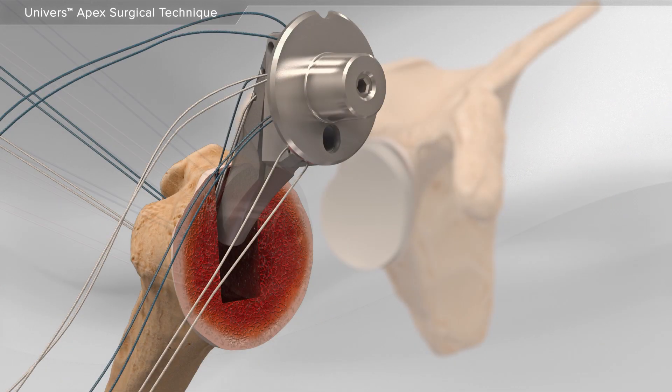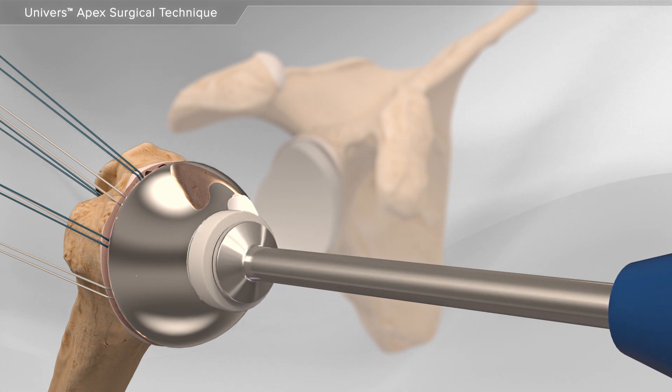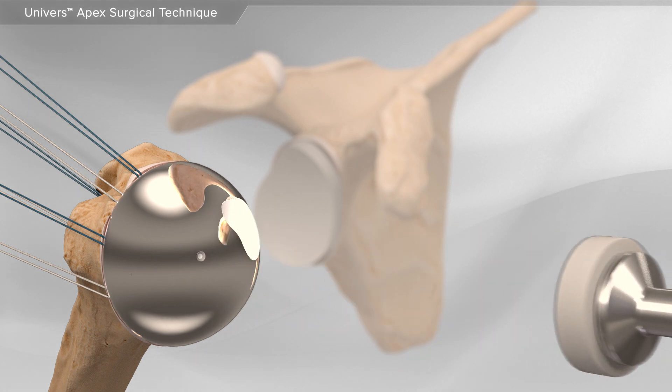Then, your surgeon will place the final implant into the humerus. A metal ball is used to replace the damaged bone.